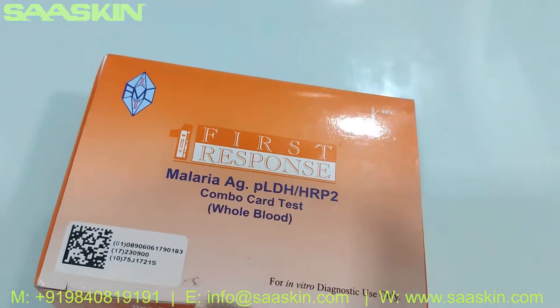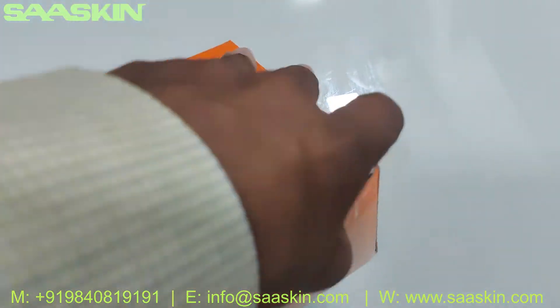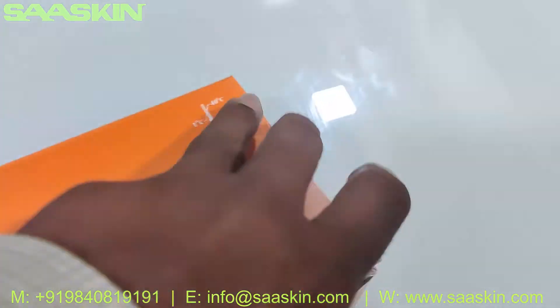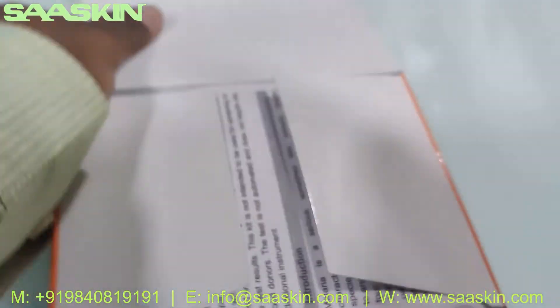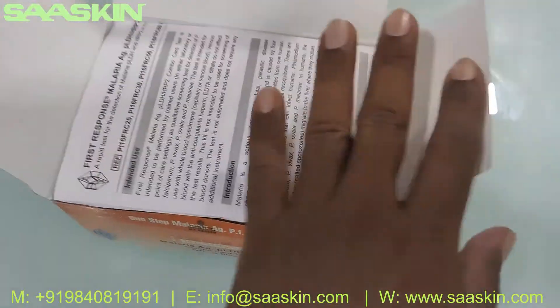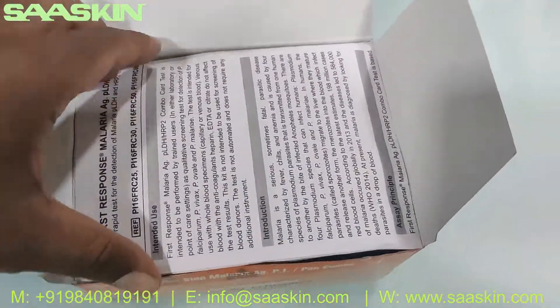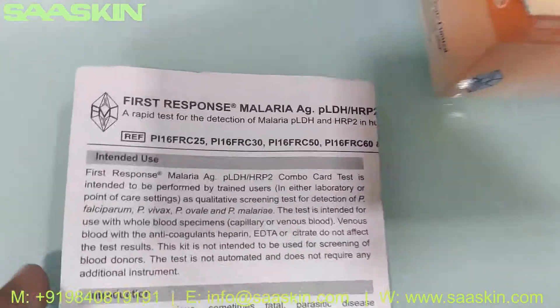Let me open this. Okay, there you go — got it opened. Inside the kit you can see there is one IFU brochure.